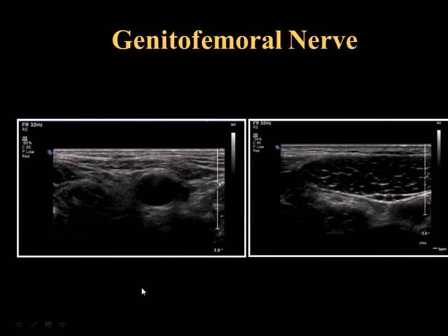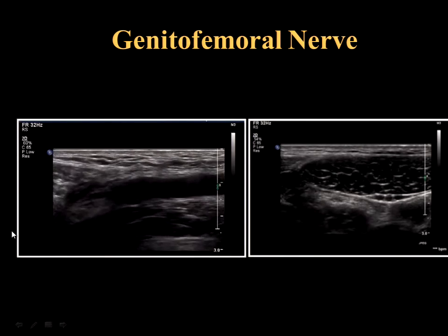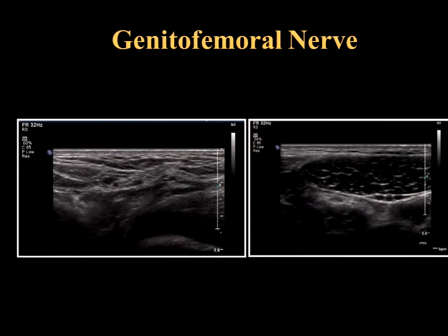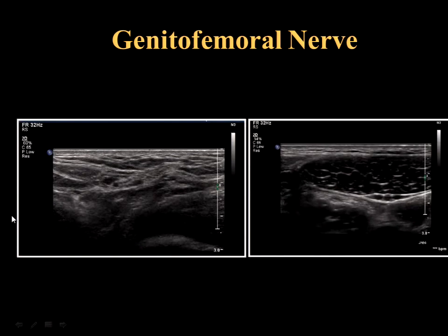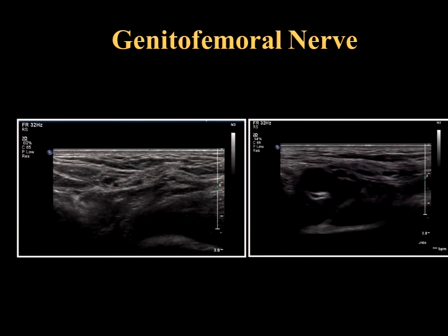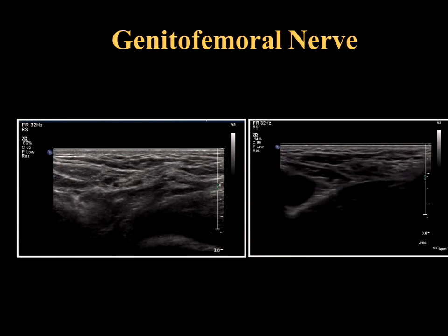In these videos, two techniques are demonstrated: scanning from the femoral artery back to long axis, seeing the inferior epigastric artery and the spermatic cord; and scanning from the rectus muscle caudally and laterally to find the inferior epigastric entering the external iliac artery, then identifying the spermatic cord crossing over and tracing down to the pubic tubercle.